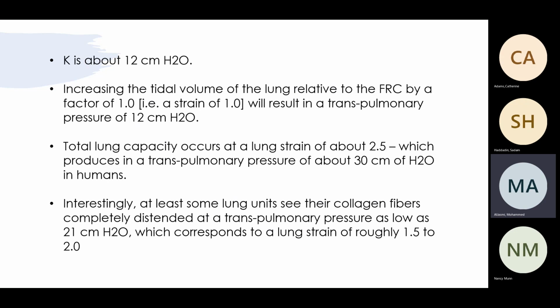But as a physician, I will come to the mechanical ventilation and start 4 ml per kg. Let's say he's an ARDS patient. He has a very small baby lung size. Okay, and then I put him on 4 ml per kg. His peak pressure is 50. His plateau pressure is 45. He's a normal patient, so we know that we should not be that high. Is that right? So that's where we brought these numbers, the 35 and 30, from this relation.